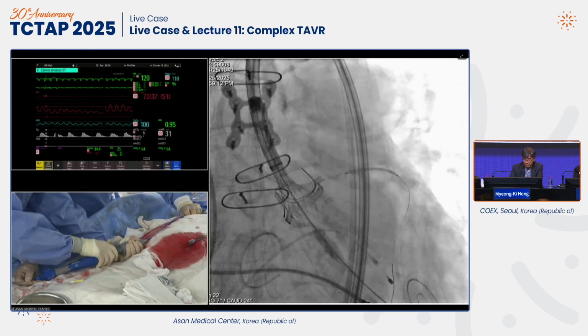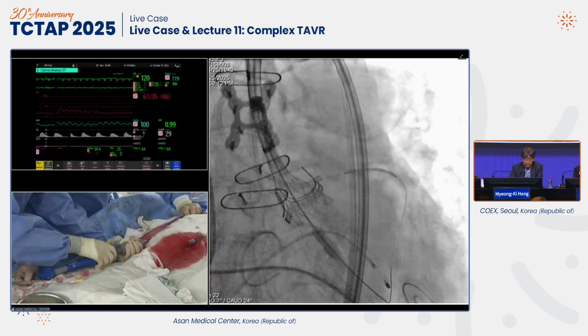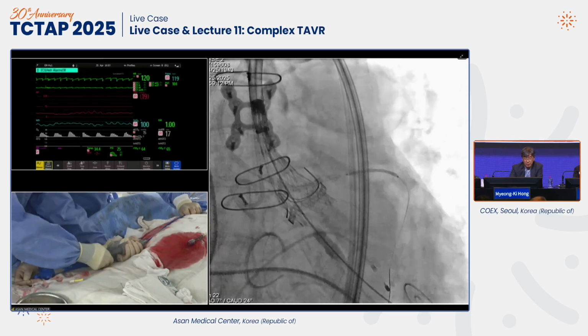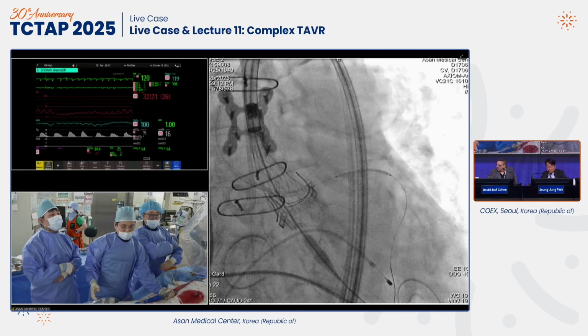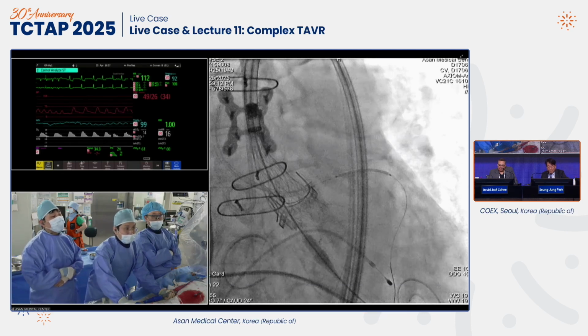Okay, release. Pressure down. Fast. Okay. Now fast, faster. What do you think, David? I think it's great. Yeah, depth-wise. Please raise the blood pressure a bit. I think it's perfect. Pacing stop. Depth-wise, I think it's a little bit better than before. Right. Yeah, we're going to wait. That was well done. And we don't know yet.